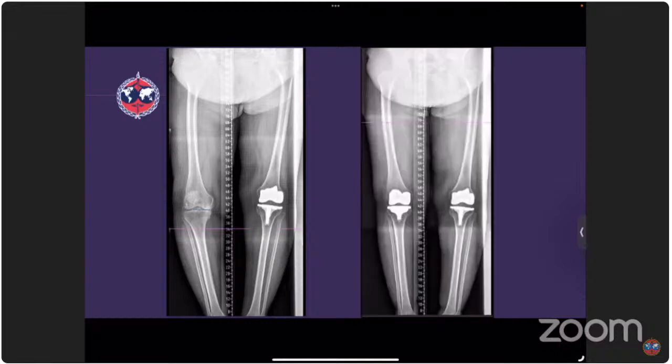If you also have a look at the joint line obliquity on the same patient, the natural joint line obliquity, as you can see, is pointing downwards. On the MA, you really change that joint line obliquity. And when you perform kinematic alignment, you notice that the joint line goes the same way as pre-operatively. And you can also see that it's more parallel to the ground.